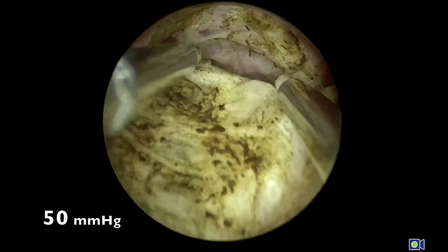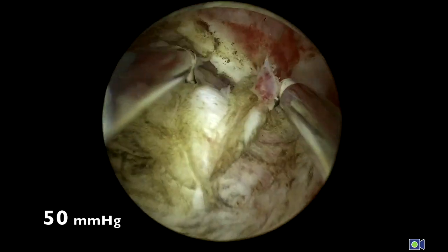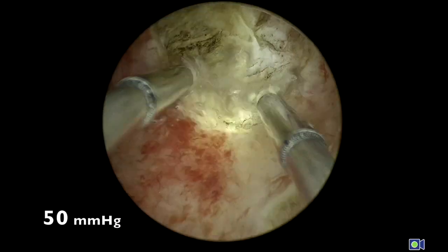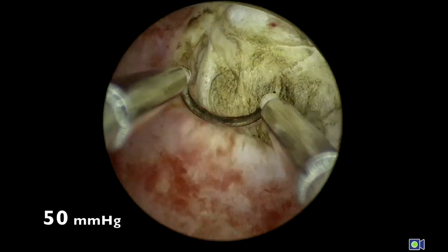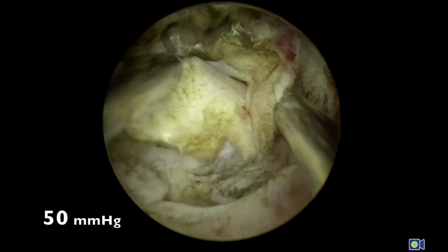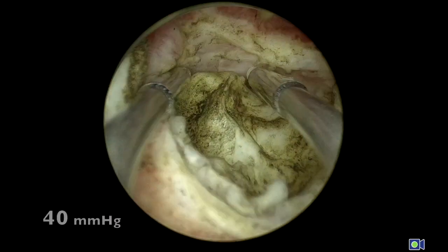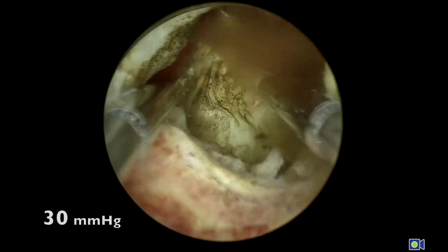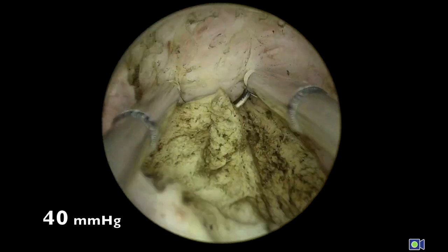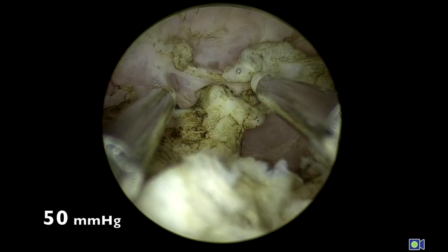We can also try to pull the fibroid out of its pseudocapsule, making sure not to exceed that border into the myometrium. In order to promote the migration of the fibroids into the cavity, we administer misoprostol the night before the procedure so the myometrial contractions will assist in enucleating the fibroids. As we get closer to the myometrium, we decrease the pressure, allowing us to see the depth of penetration and the endpoint, that is the pink myometrial fascicles that you see right here.